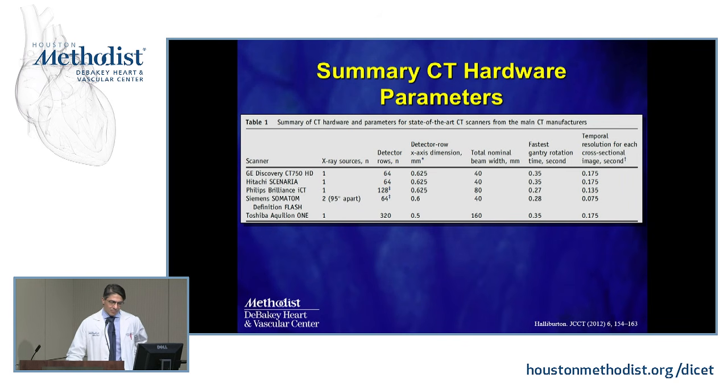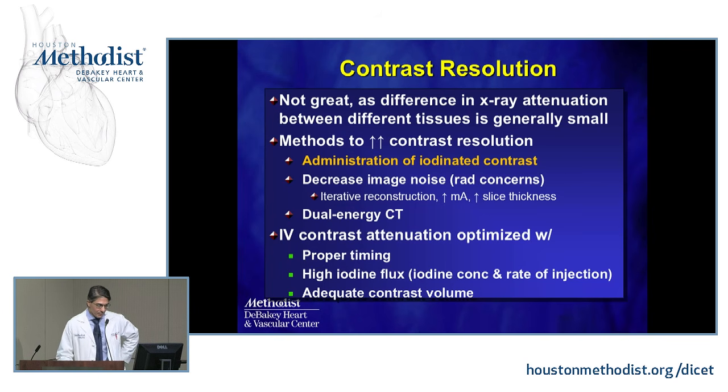And this is just a summary slide showing you a discussion about the different detector and rotation times and temporal resolutions of all these different machines that are out there. Temporal resolution on most of them is the same until you get to, of course, the dual source. Spatial resolution is about the same, but they have different coverages. Okay, so we talked about temporal, we talked about spatial resolution, we talked about coverage.